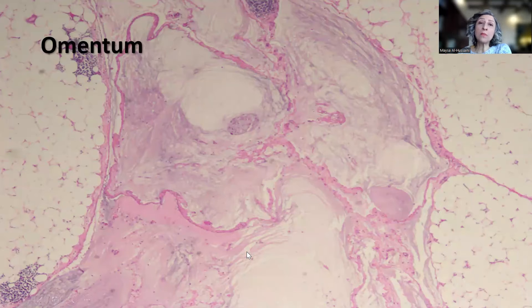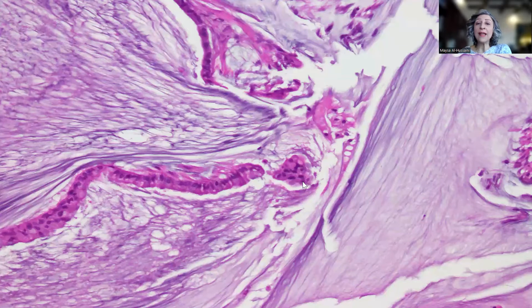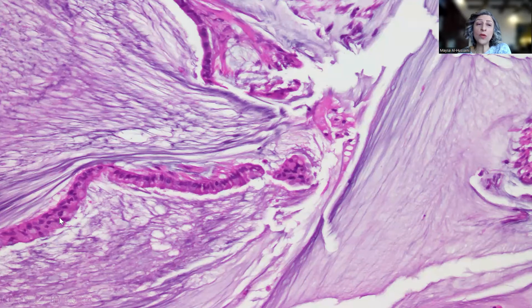Remember that you always have to look for the presence or absence of epithelium, because this really would affect the staging of the disease. And on high-power magnification, as you can see, strips of epithelium.